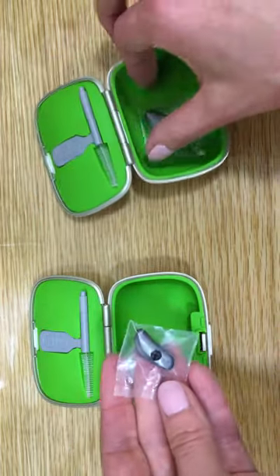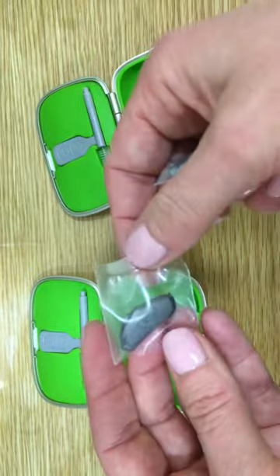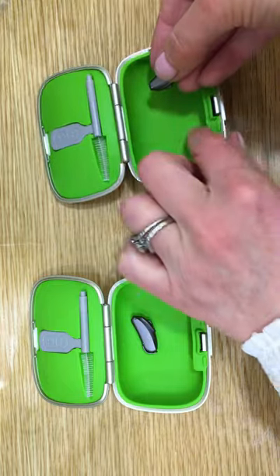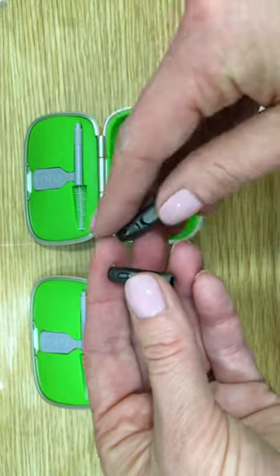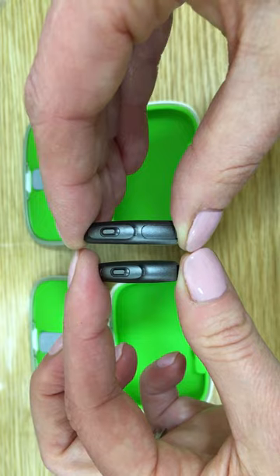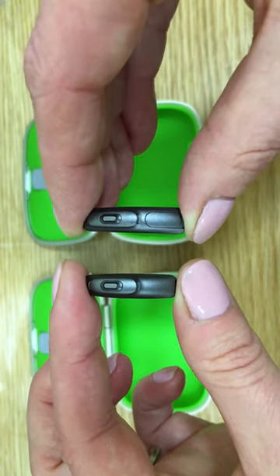So here we have on the left the size 10 instrument and on the right the size 312. Both instruments will come sealed. On the right we have the size 312 instrument and on the left we have the size 10 instrument. This colour is graphite grey.